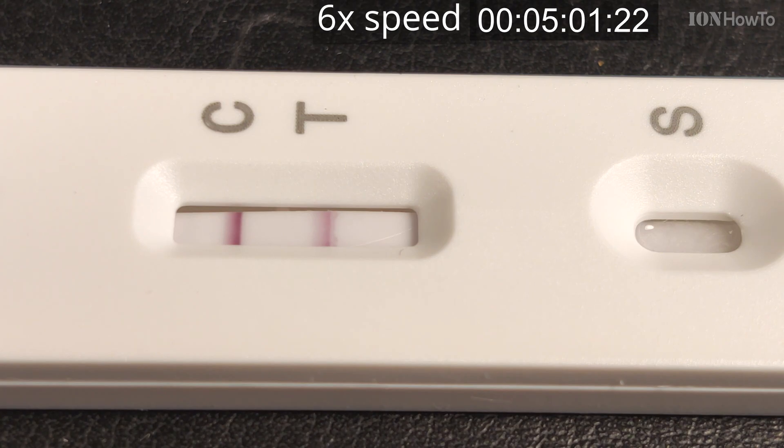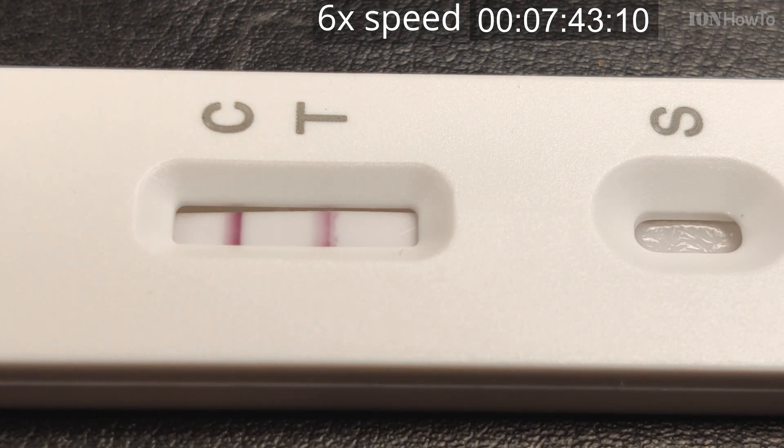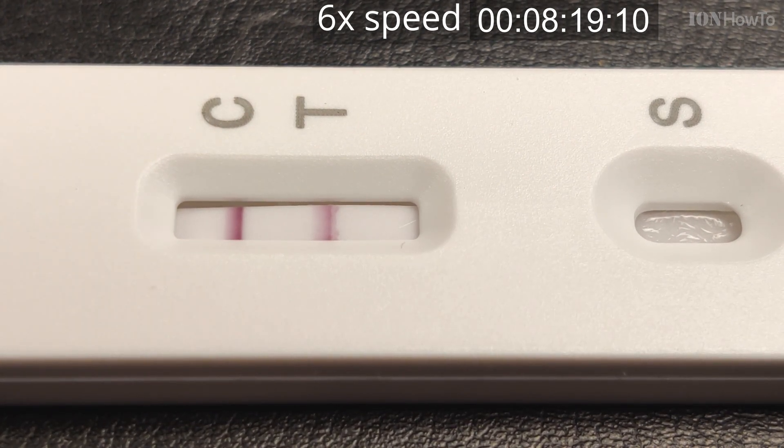It depends on how strong the line is. If it's very weak, as it was showing in the first minute of this video, it might mean the amount of virus in the sample is lower — hopefully meaning it's not so bad. But it could also mean the swab just didn't collect enough virus from the nose. If the swab isn't inserted properly, the test may show slowly.